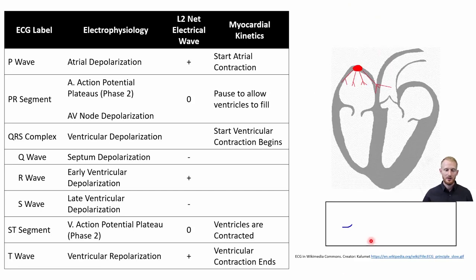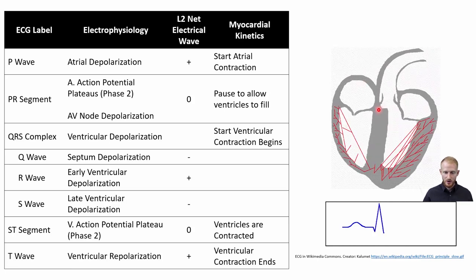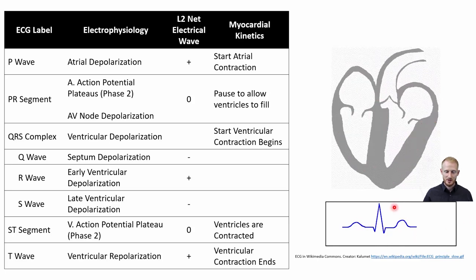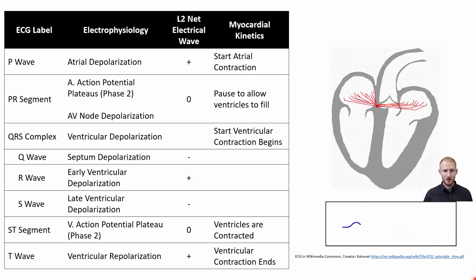And so if we put it all together, you can see in this diagram here, the electrical activity moving through the heart goes from the SA node through the atriums to the AV node, through the ventricles, and then sort of up the sides, and then here comes the repolarization wave going the opposite direction. Right? And that's what gives us this ECG tracing that we anticipate seeing on a lead two electrocardiogram.